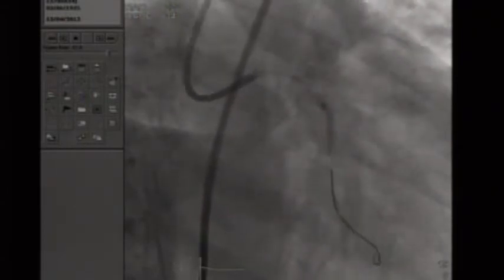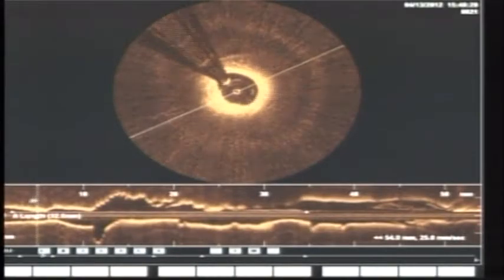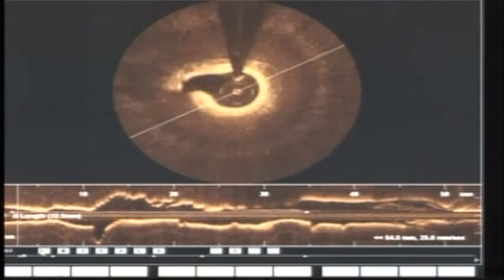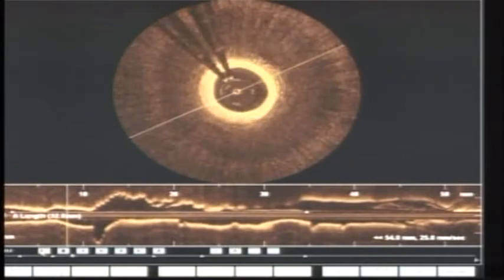Andre, you comment on this. If you could just change to the OCT for this one. Yes, you can see it, Alex and Ron. So this is post-dilatation. Here we have the run. It's just one run for this lesion on the OCT.